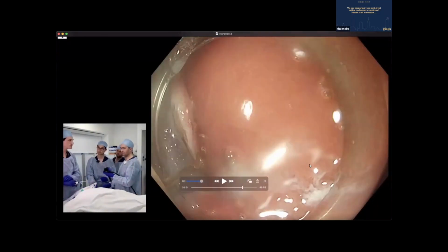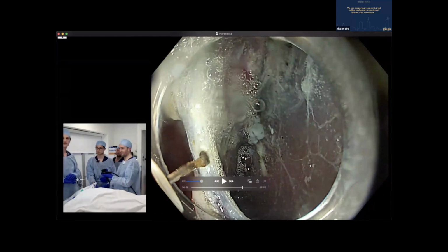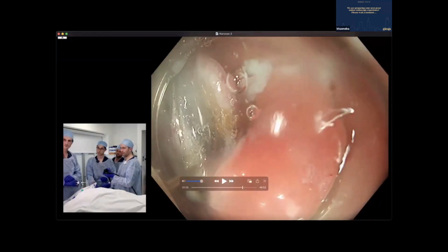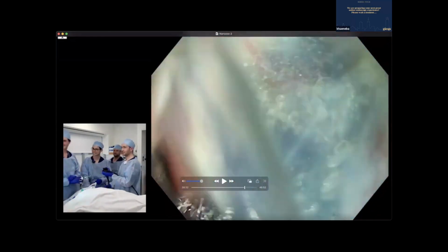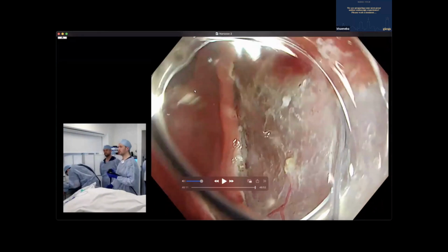And anyway, you see what you can do with traction. And as John said before, when you're cutting and the tissue is moving, right, which is happening here. I'm doing it and it's just moving away. This is ideal traction. And look what's happening here. As soon as I touch it, it's pulling off, almost opening up completely. So that's ideal traction. And in the end, touching up the vessels.